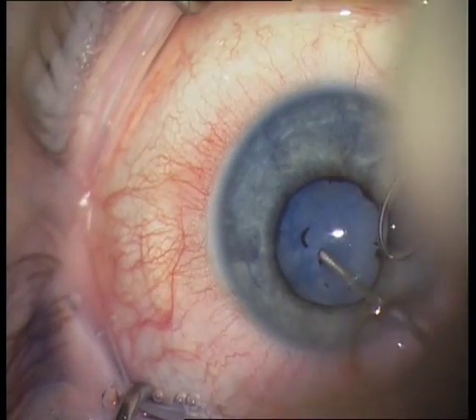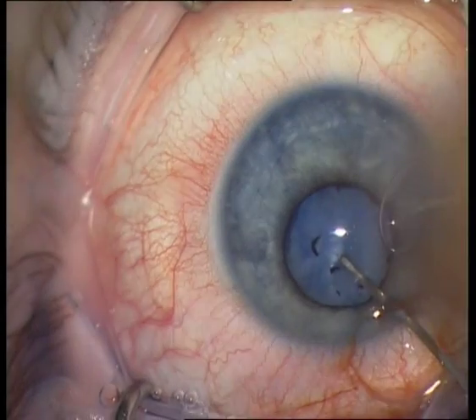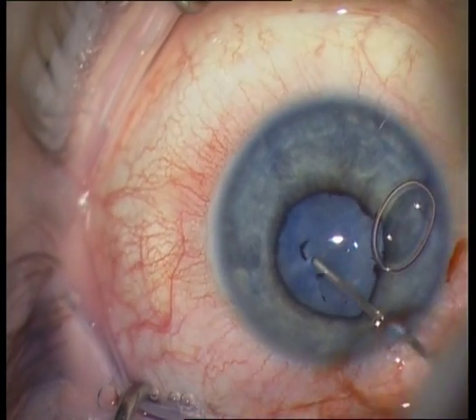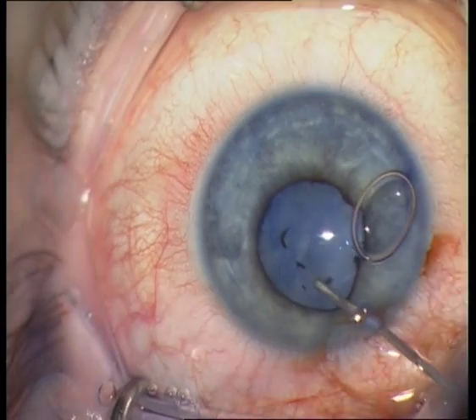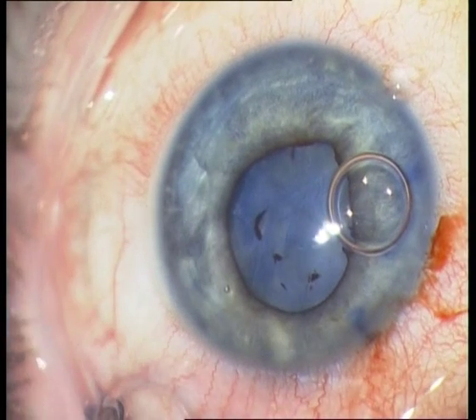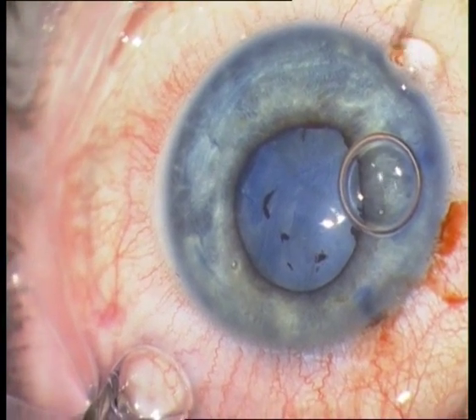I am now trying to pinch a hole inside the anterior capsule with a cystitome, but I do not succeed because the anterior capsule is very, very thick.